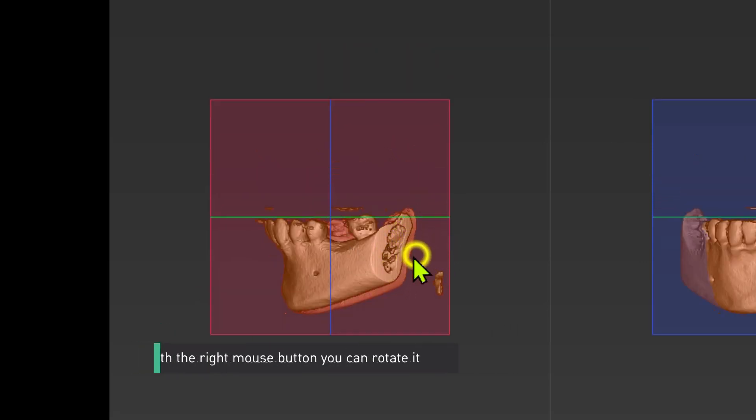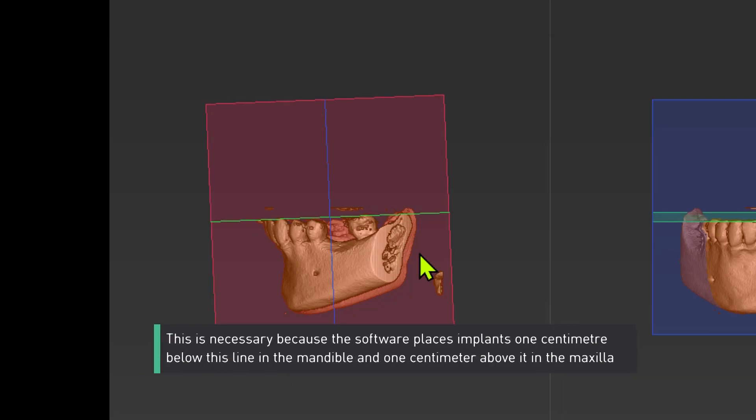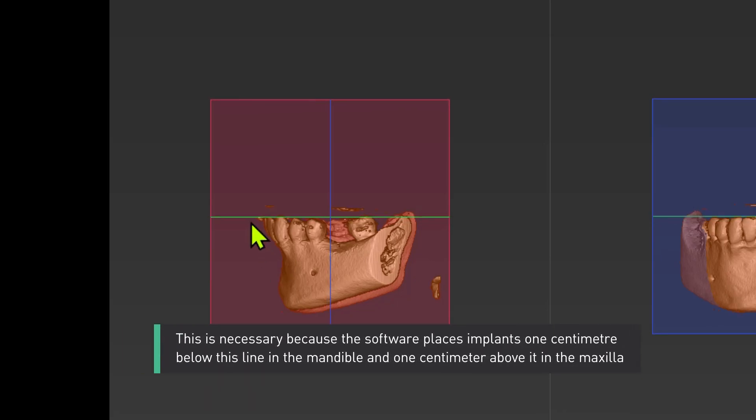With the right mouse button you can rotate it. This is necessary because the software places implants one centimeter below this line in the mandible and one centimeter above it in the maxilla.